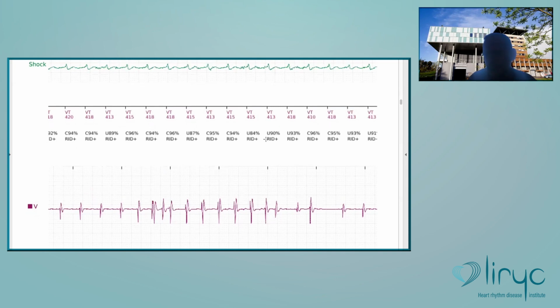That's a quite serious situation in this patient. So clearly today, I don't know if we systematically program 83% as a first intention, but I would not recommend remaining at this value of 94% because the specificity is very, very low with this number.